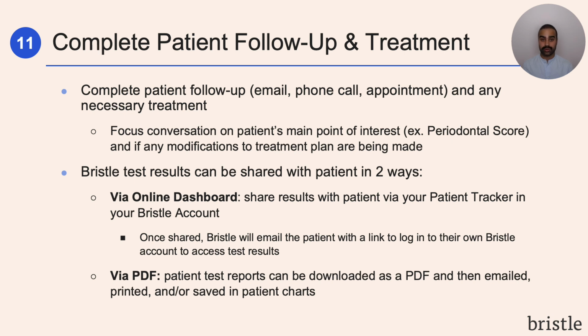There are 2 ways you can share the results with patients. So the first is via the Bristle dashboard. If you go into your patient tracker, you can toggle the share button so that those test results are shared with the patient. And what that does is causes Bristle to email the patient with a link to access their own Bristle account where they can log in and view the test results online. And the other option is to simply download a PDF of the test results, and then you can email it to the patient or you can print it out to be able to show them next time they're in for an appointment.